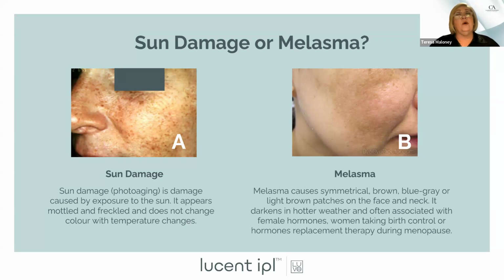If you're removing something and there was a cancer there, let's say you went after something and targeted something, and you get away, oh, I removed something, now they're not going to know. When you do an IPL treatment and you bring things to the surface, something that was brewing beneath the surface might come forward, and you catch it actually ahead of time. One of the biggest things, if someone has a basal cell, is if they say to you, I have this lesion on my face and it heals and then it bleeds. Every time I just wipe it, it'll bleed and then it'll heal. That tends to be a sign that that could be something that you want to have your dermatologist or physician look at, because something shouldn't keep bleeding and healing, bleeding and healing. It resolves, or there's maybe a deeper issue there.